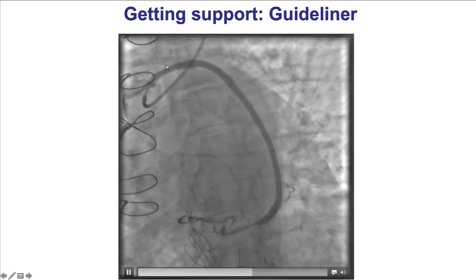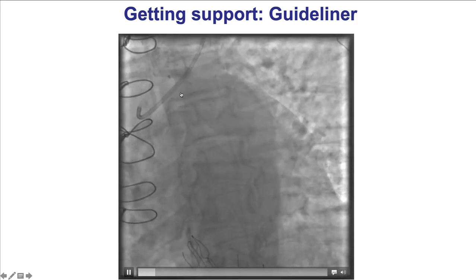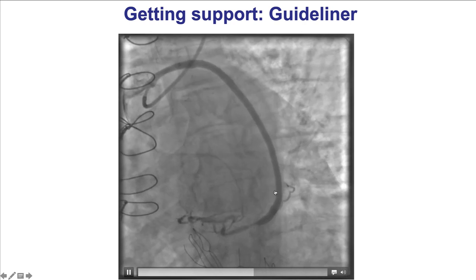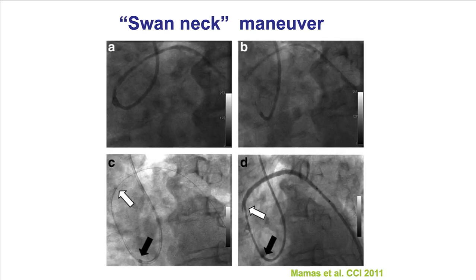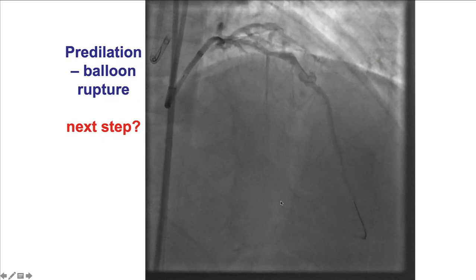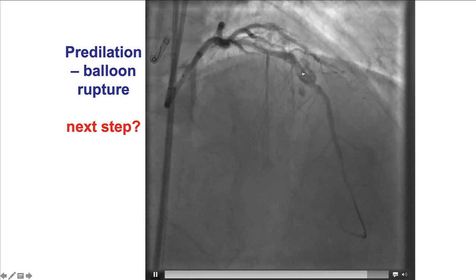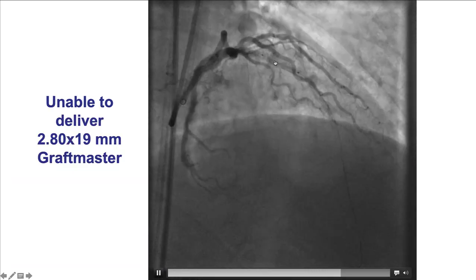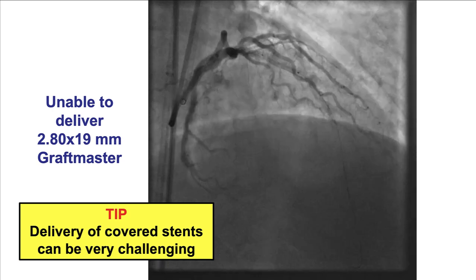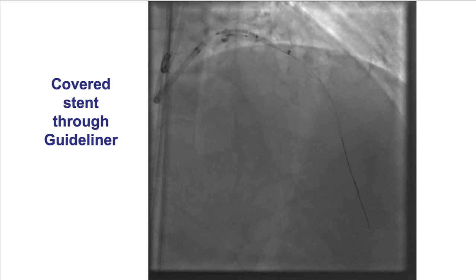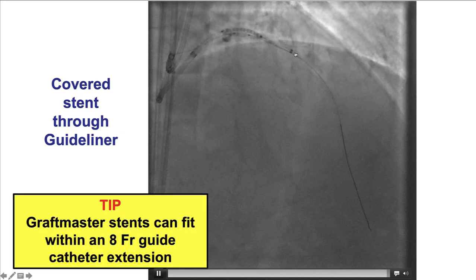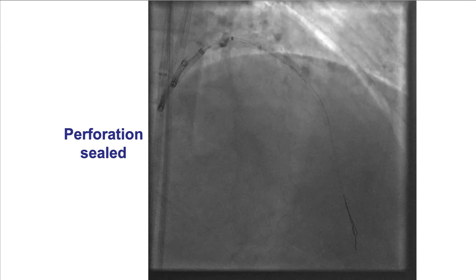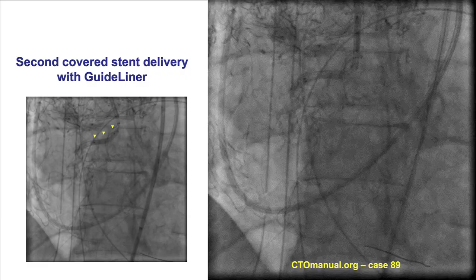This is an example showing how a deeply intubated guide catheter extension can facilitate the support for equipment delivery into this saphenous vein graft. Sometimes there can be a maneuver in which the guide extension is advanced deeply into the vessel, and then the guide is resting against the aortic wall, facilitating extra support. This is an example of a coronary perforation in which a graft master could not be delivered through that area of perforation because of calcification and tortuosity, which is not uncommon for covered stents. But using a guide extension, the graft master could be successfully delivered to that area of perforation and successfully sealed that perforation.